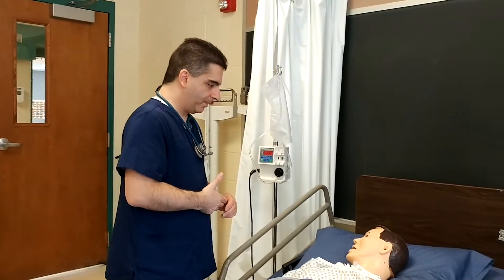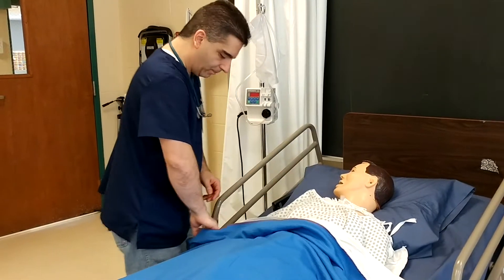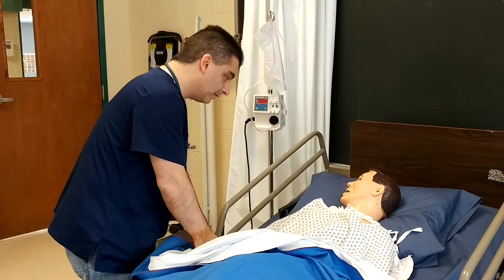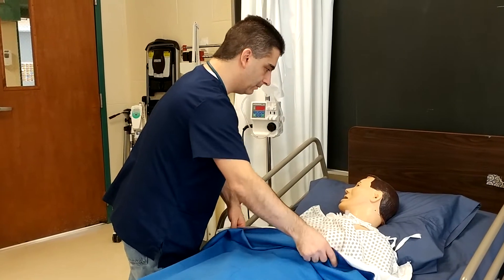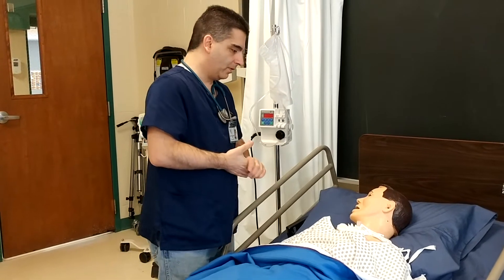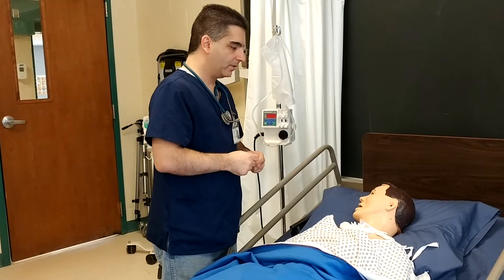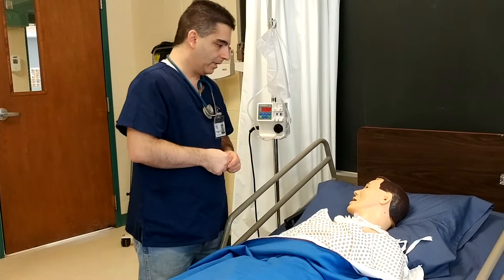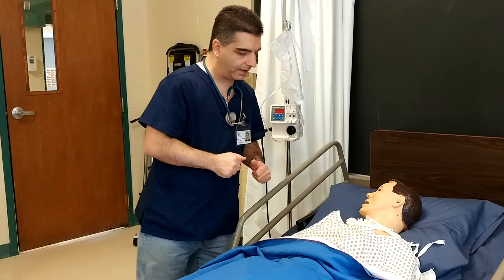Hi, Mr. Jones. Hi, I'm Jim. I'm going to be your nurse today. I'm an LPN, and we'll check the bracelet. First name's Charles — my uncle's name is Charles. How you doing? The reason why I'm here: your doctor ordered a straight catheter on you, which is a clean urine sample. Any questions? I'm going to wash my hands and I'll be right back with my supplies.